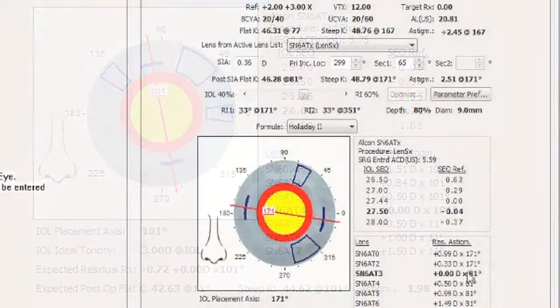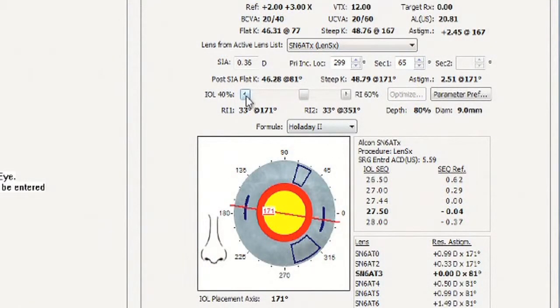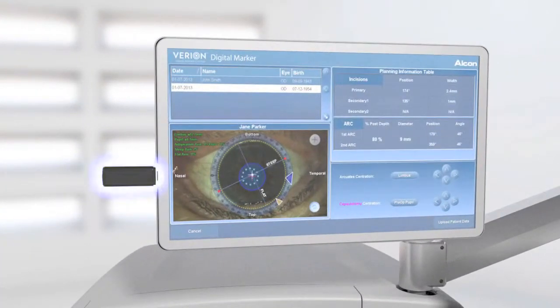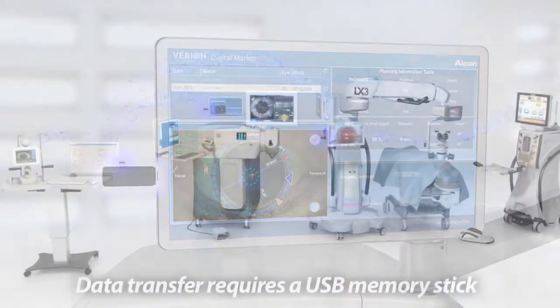Surgeons can now determine optimum incision locations to individualize surgically induced astigmatism and toric lens powers at the same time. The reference image and surgical plan are transferred from the Veryon reference unit to the Veryon digital marker via USB stick.